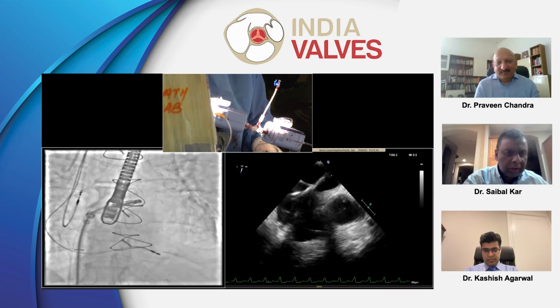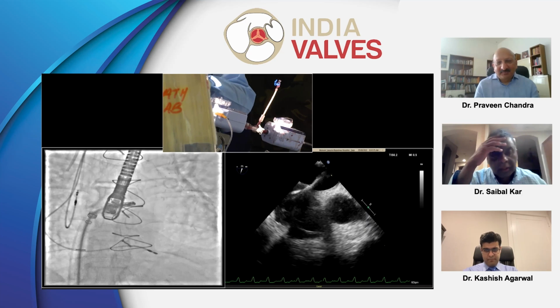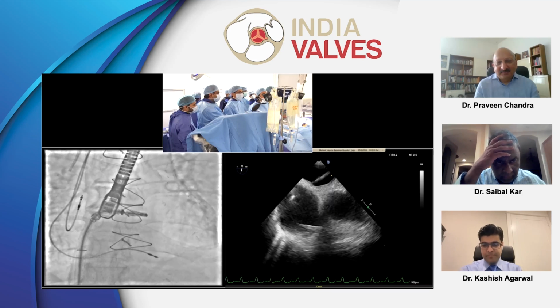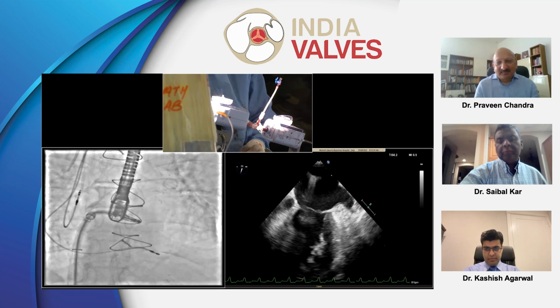Okay, pull back the system, right? Yeah, the DC handle. Just pull back the DC handle. I'm going to straddle a little bit more. Yep, there. That's good. Actually looks pretty good height wise and everything.